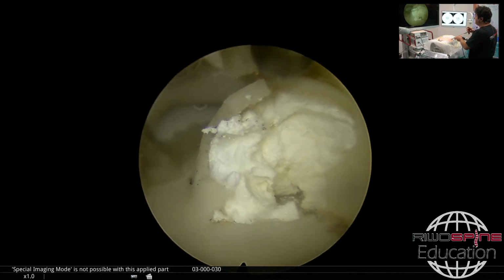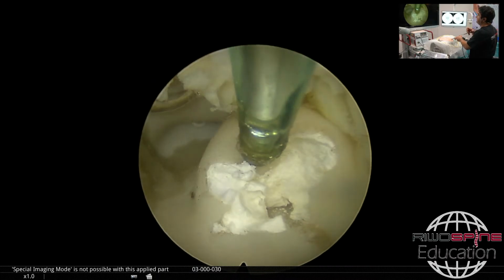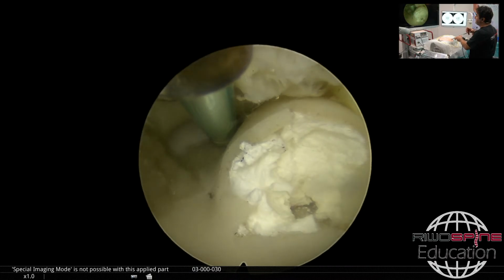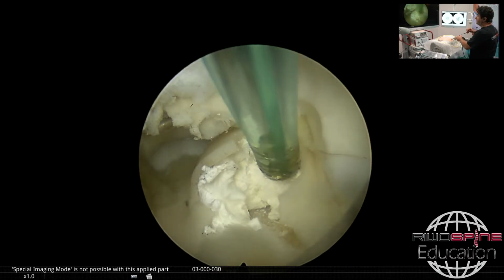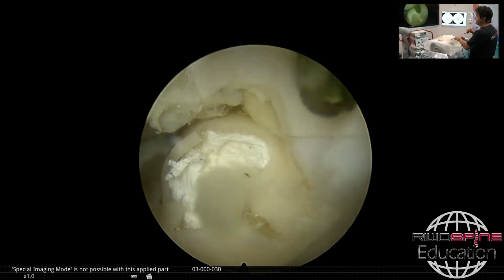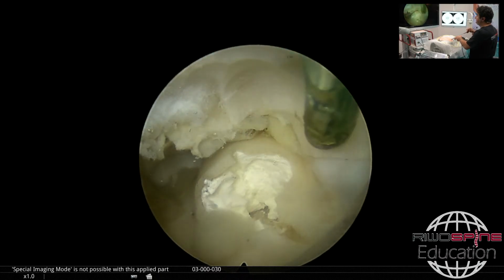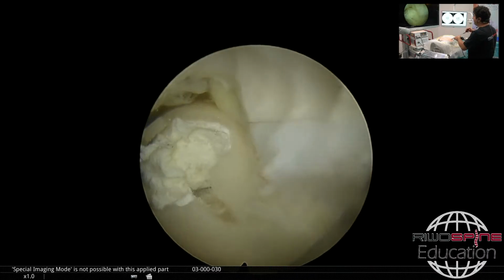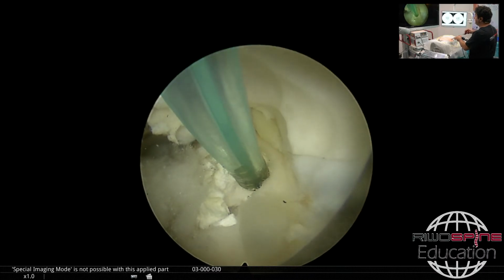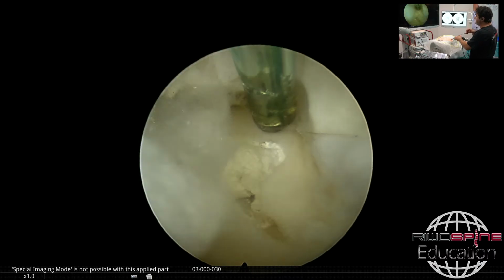If you want to try to pass through this foramen with your instruments to reach the spinal canal, or if you choose the transforaminal approach for the caudal migrated herniations especially, then you need to do a resection definitely here too much to reach that, because there's a pedicle here that you cannot reach behind the pedicle in this direction.